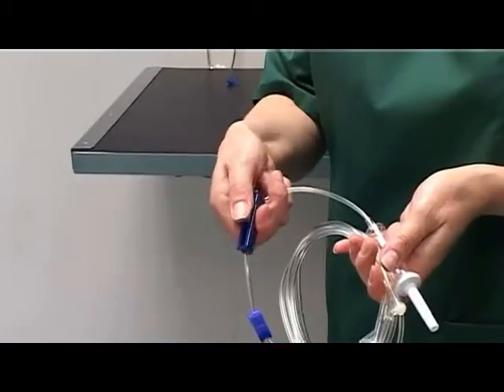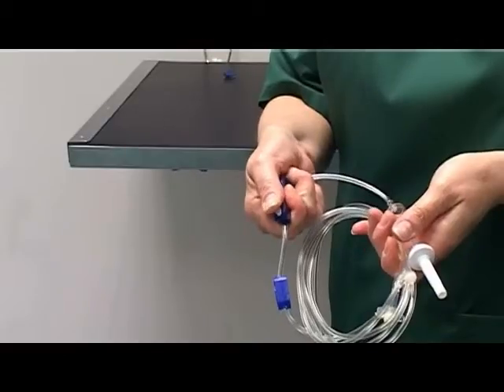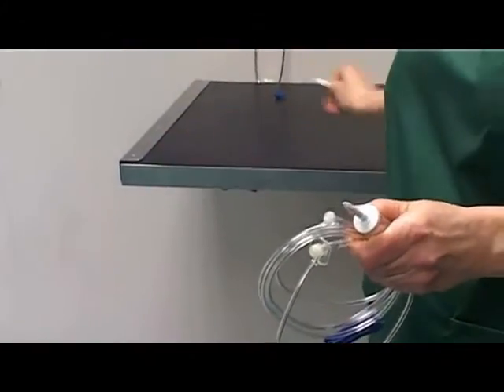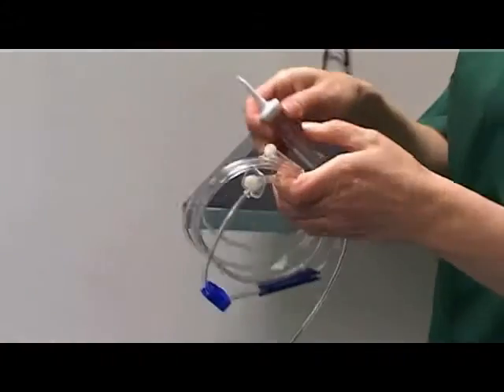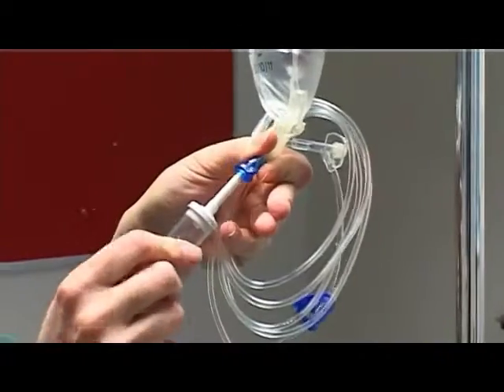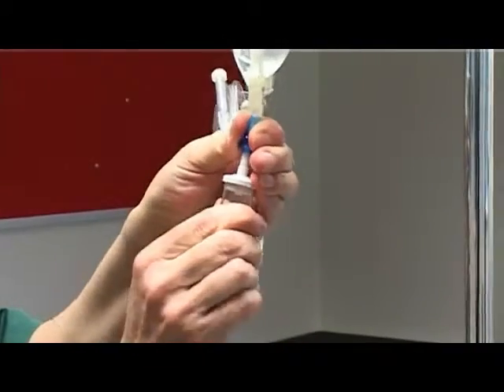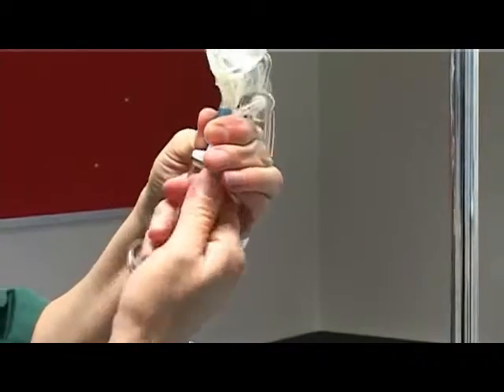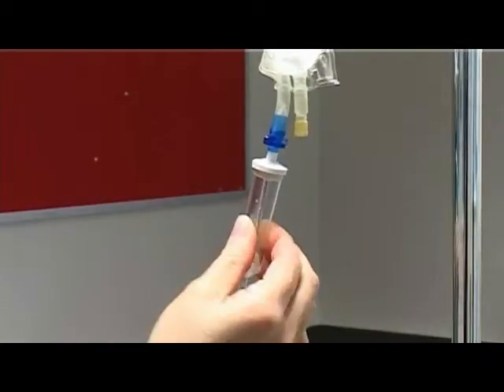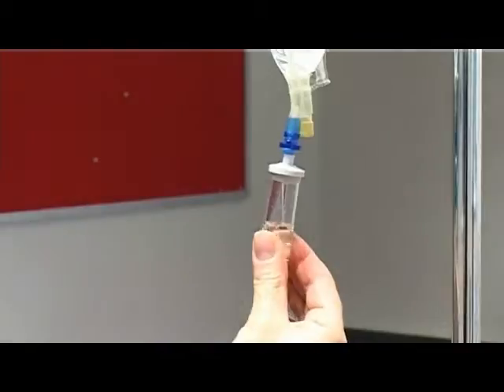Turn off the regulator. Insert the administration set into the fluid bag using an aseptic technique. Squeeze the chamber approximately one-third to three-quarters to fill.